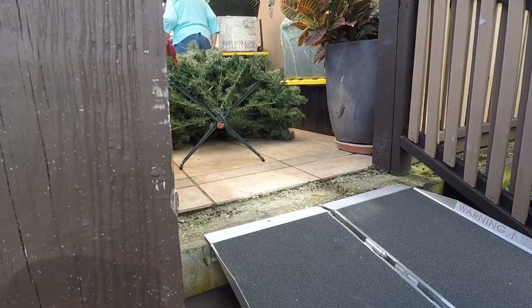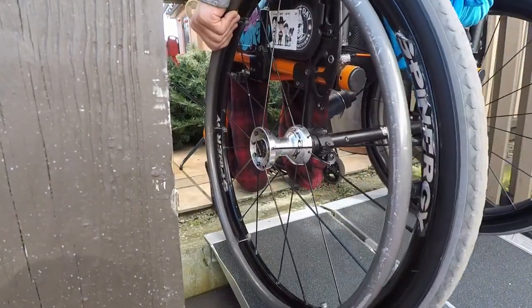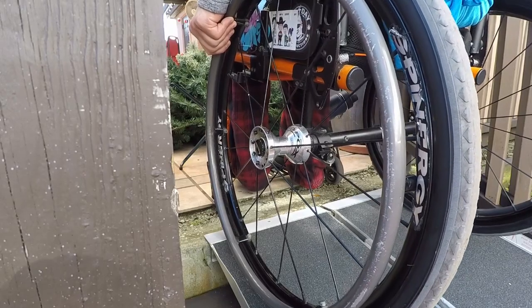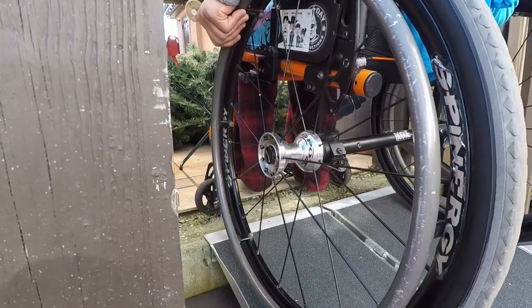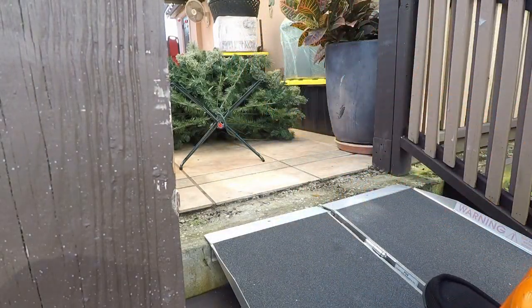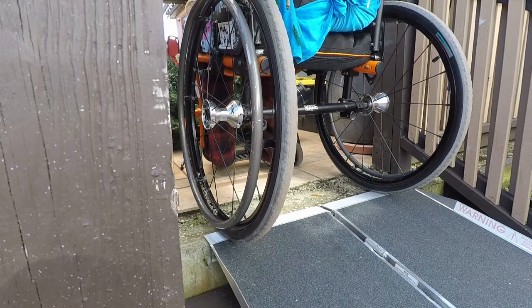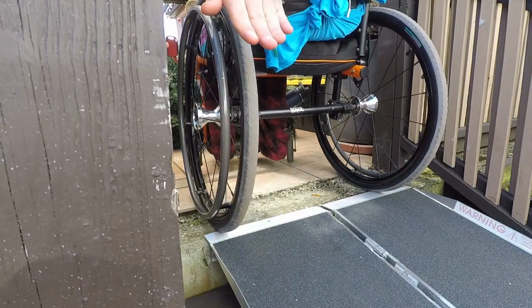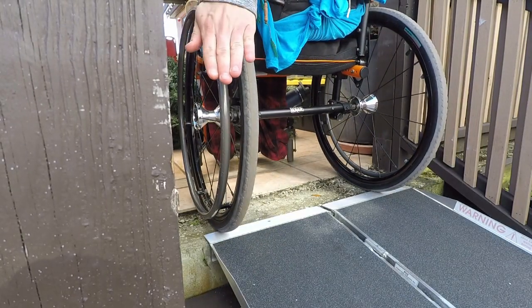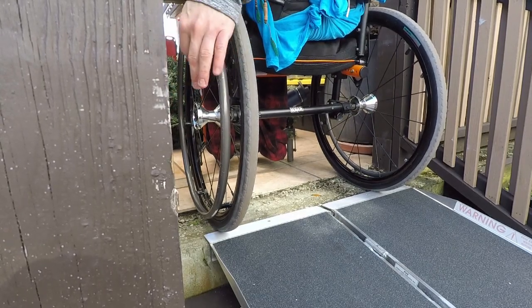Once I'm up here I still have this little tile lip that you can't just roll over — you need some strength to push through it. What I do is zoom in and give a good push like I'm doing a wheelie. Since I'm on an incline or decline, the wheelie doesn't look obvious, but I initiated it at the right time so the front wheels clear the lip without a hiccup or jolt.